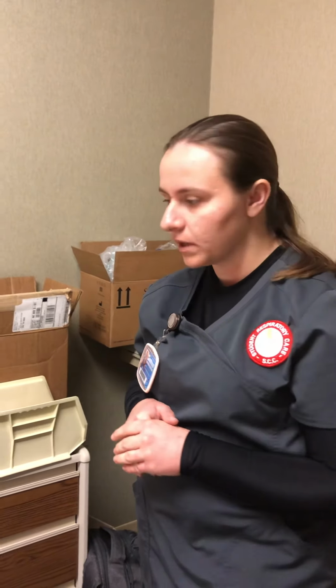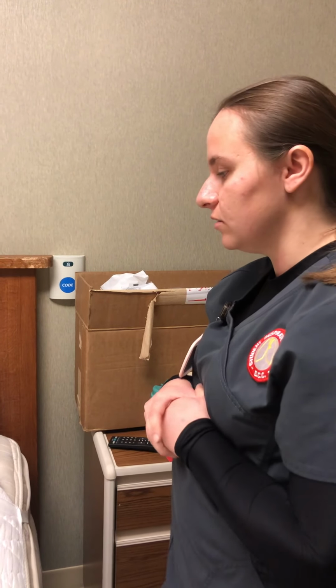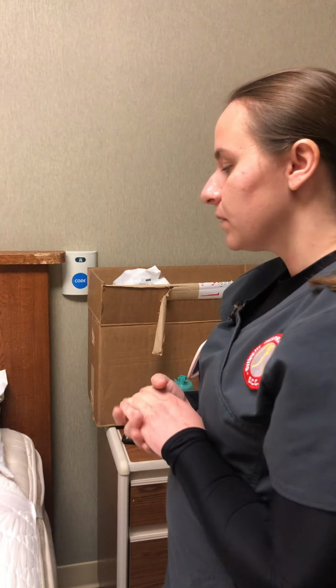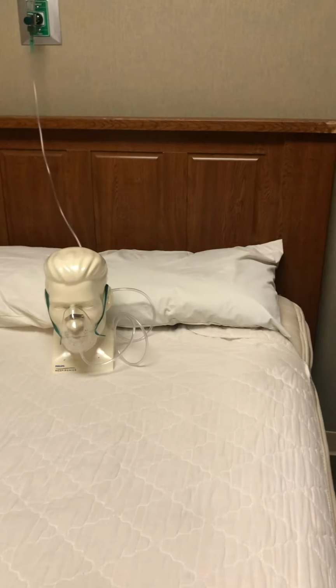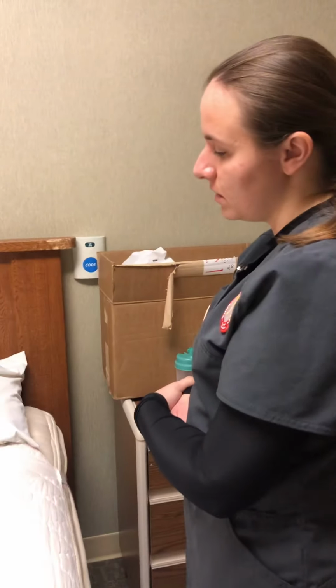So I'm going to change them to a nasal cannula just to start weaning them off that oxygen. All right, I knocked on the door and introduced myself and checked the ID band. All right, so I'm just going to listen to your lungs and get your vital signs. The doctor has ordered that you are ready to be starting to be weaned off of oxygen. So I'm going to change you to a different device that can fit to the flow that the doctor would like you to be at.